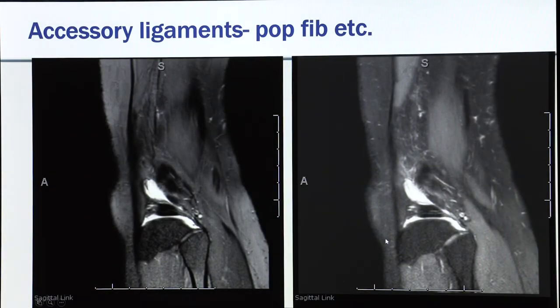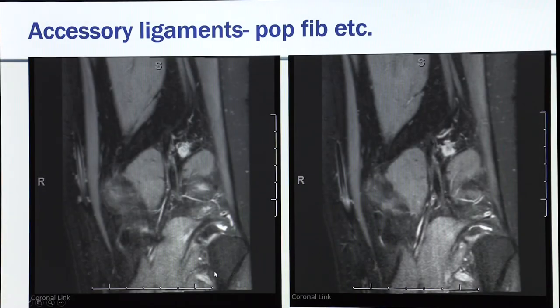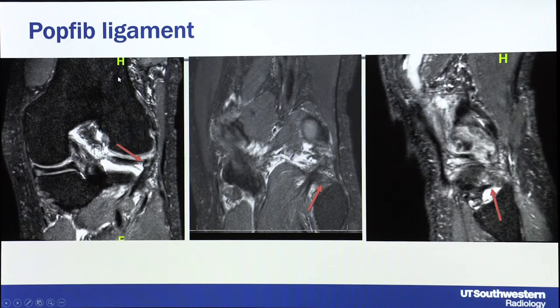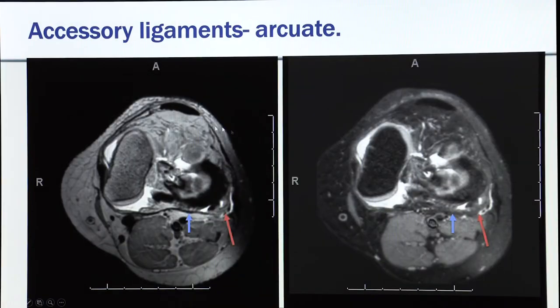Smaller ligaments are also visible: the meniscofibular ligament, the popliteofibular ligament on coronal images, and injury to that structure — a bone fragment avulsed with the popliteus tendon attached, and the popliteofibular ligament quite thick and frayed. Accessory ligaments like the arcuate ligament are best seen on axial images: the medial band and lateral band, where you can see the lateral band is torn on both non-fat-sat and fat-sat images.